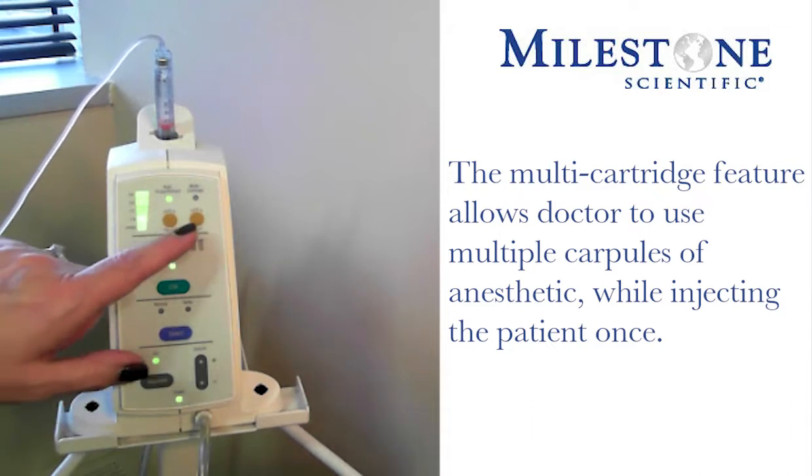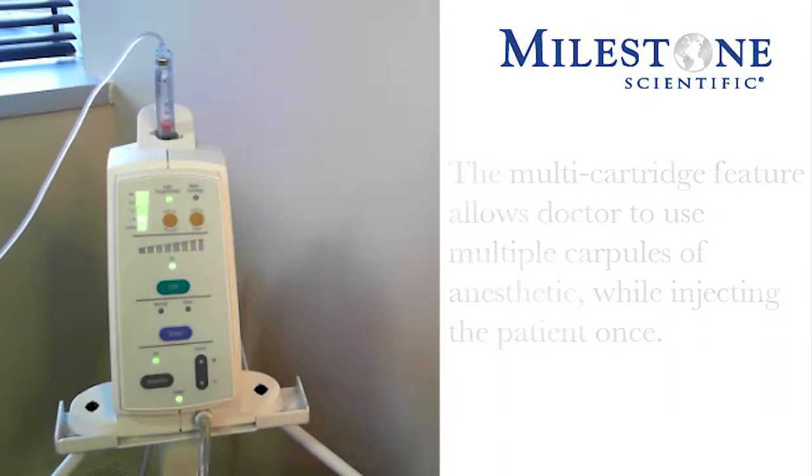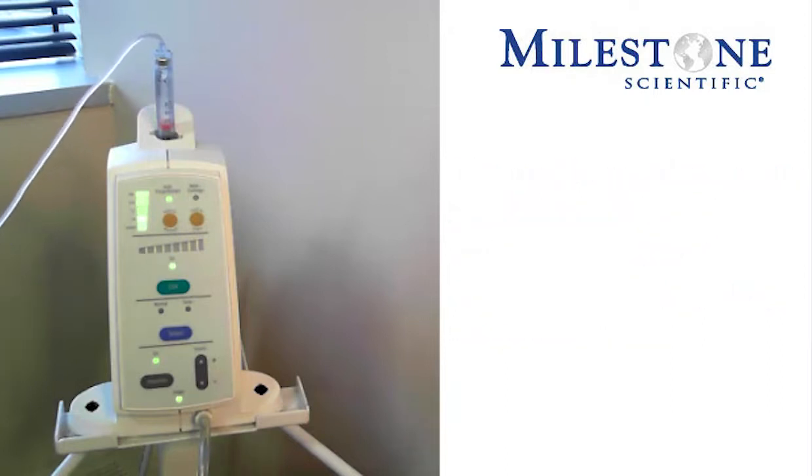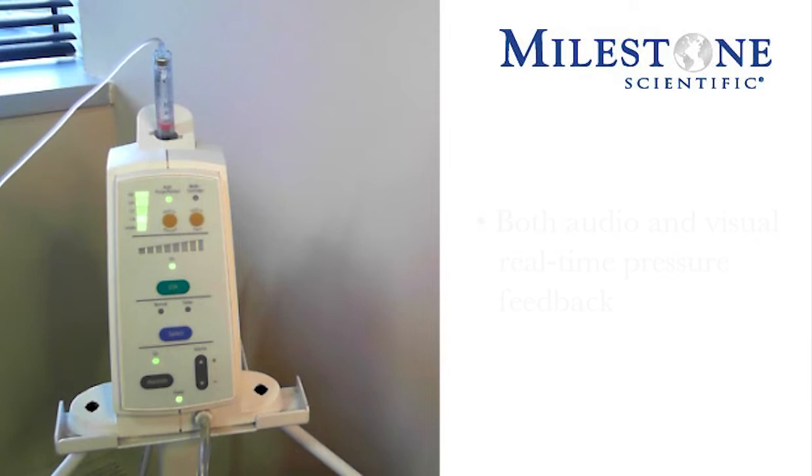There are two gold buttons, one of which is a hold-to-train button. The hold-to-train button gives you positive voice prompts to the different sounds and tones associated with the instrument. The instrument has both audio and visual real-time pressure feedback. So when that training mode is activated, it's basically going to give you a tone and then tell you what that specific tone is and what the instrument is doing.